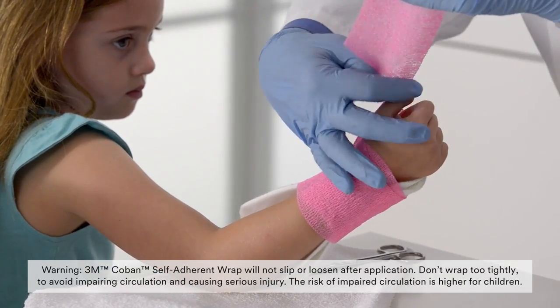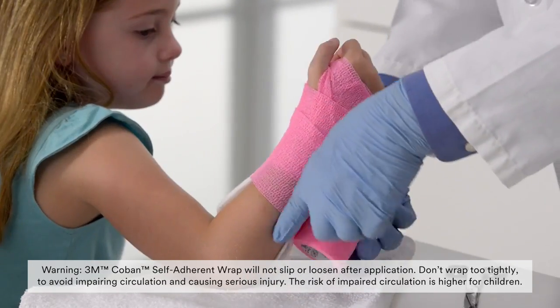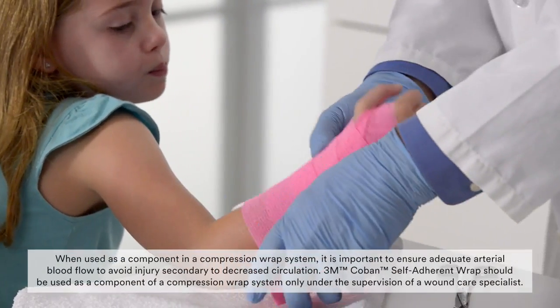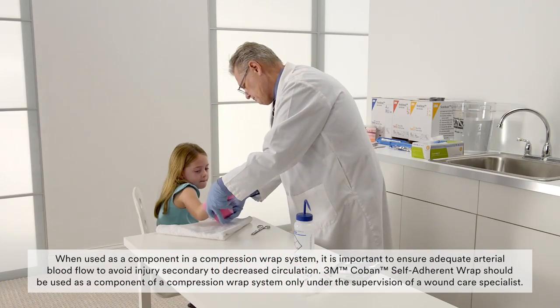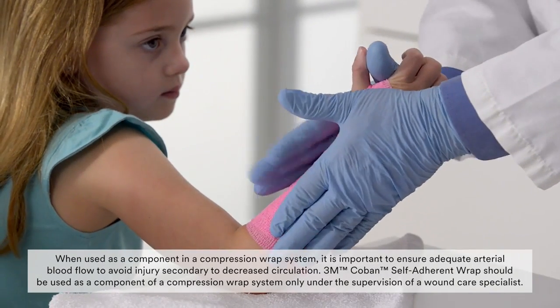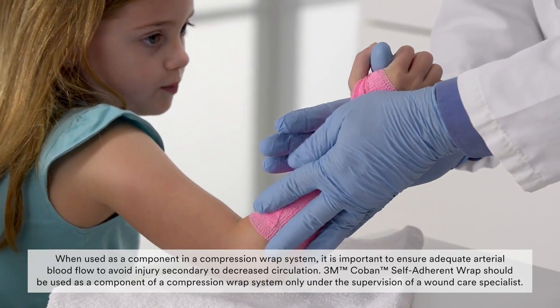Begin wrapping at the wrist, working up toward the distal palmar crease. Then, wrap proximally, overlapping each rotation by 50%. Mold the palm of the splint by holding the patient's thumb between your thumb and forefinger and pressing the ball of your hand into the palm of the splint.